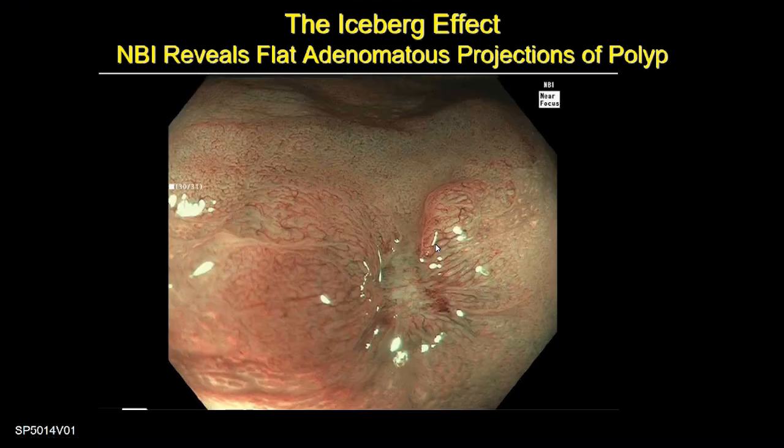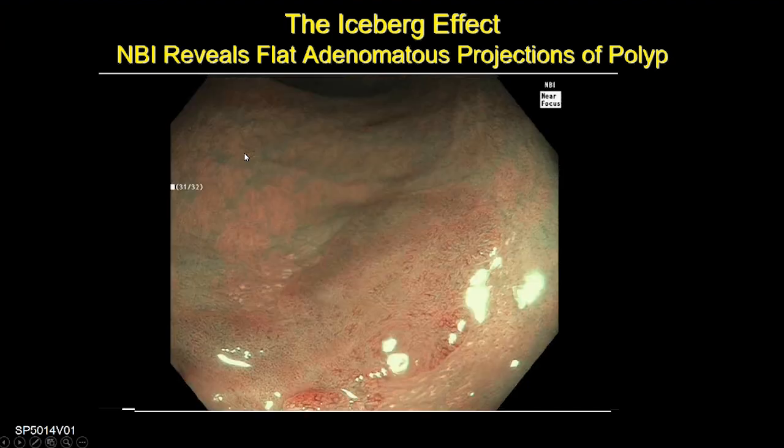And here is with near focus. You see the near focus sign when you hit the near focus button. But let's look over here where it's obvious. Let's look where my cursor is right now. You see where it is right now? All that area, you can really see the extent of that adenoma.